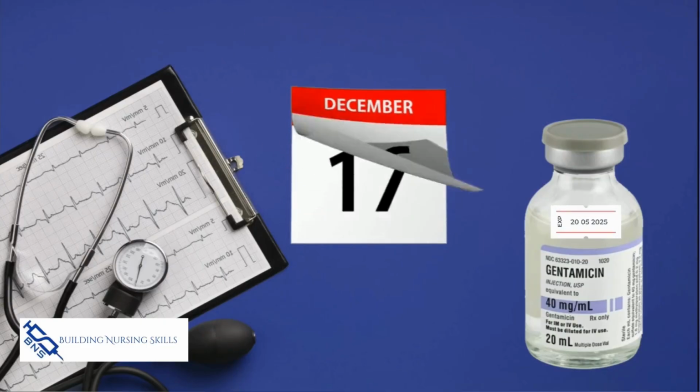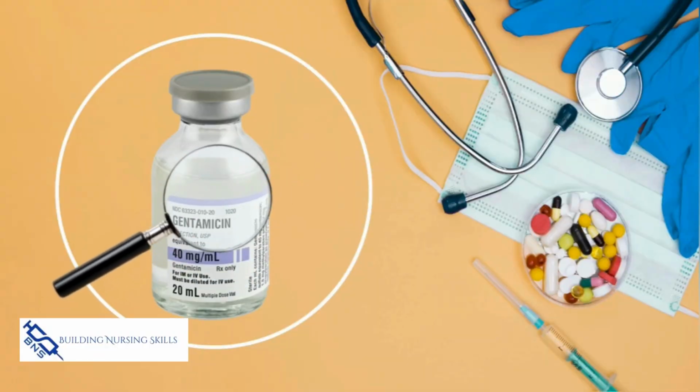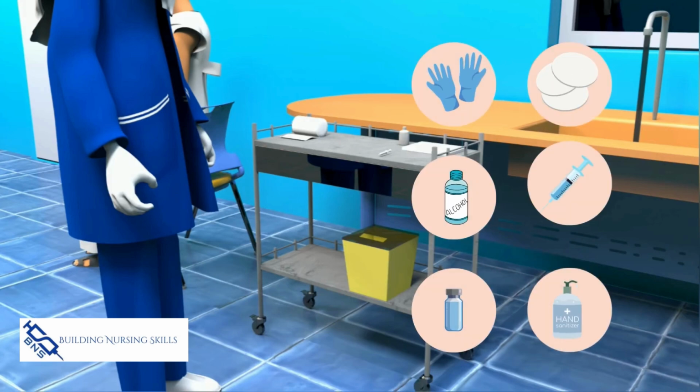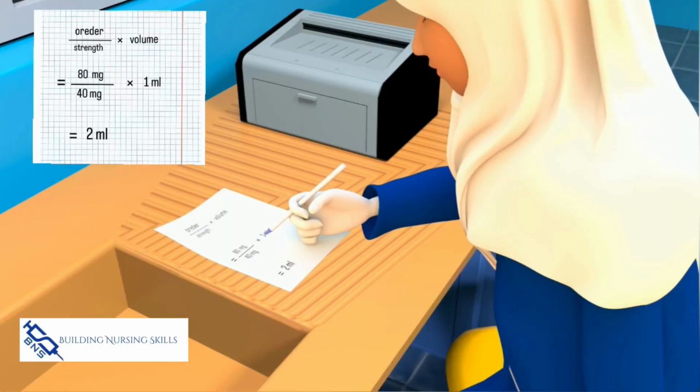Checks the expiration date on the medication. Visually inspects the solution for particles, discoloration, or other loss of integrity. Chooses equipment appropriate for the medication and injection site. Checks or calculates the dose correctly and verifies as necessary.